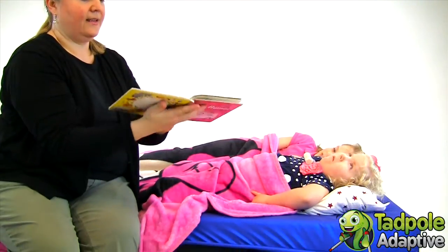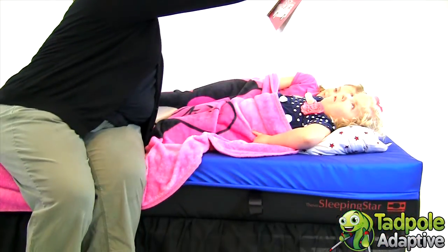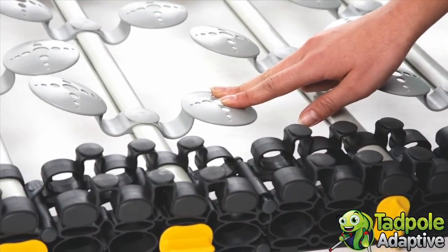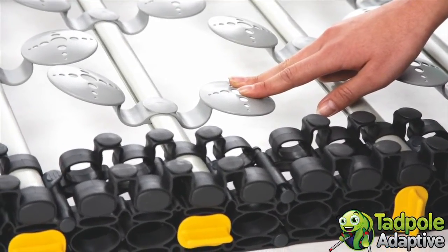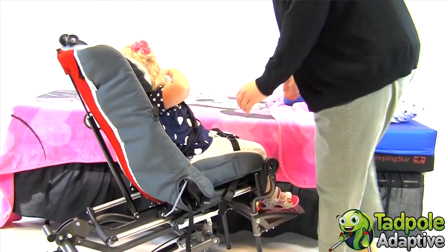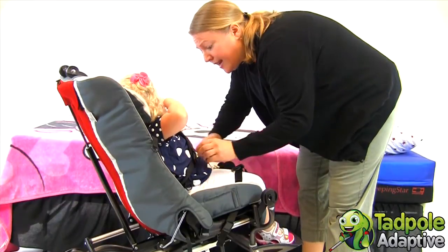In order for any of us to get into a deep, restorative, rejuvenating sleep, we need a combination of relaxation and movement. With Sleeping Star, the suspension system is providing that movement — even a movement as slight as a child's breath — there will be a counter movement and a feedback movement.